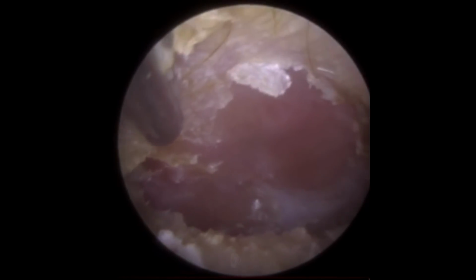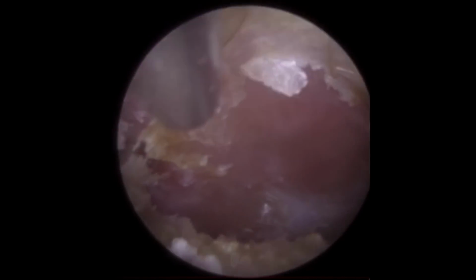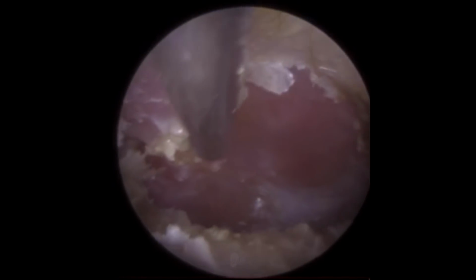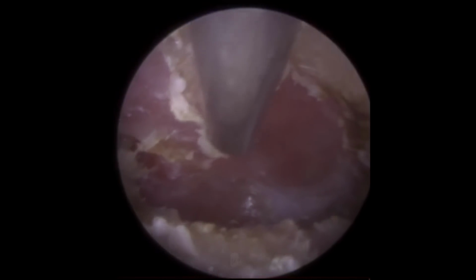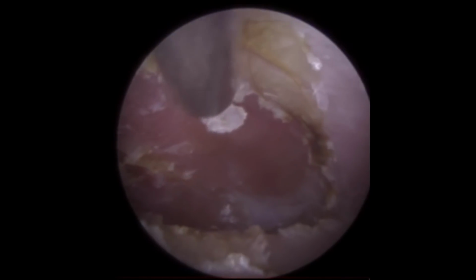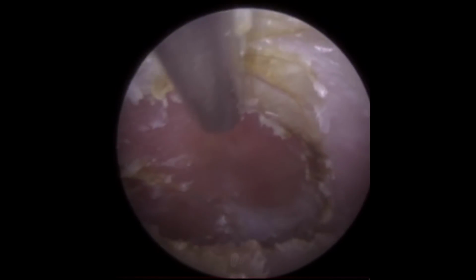So after I finished the procedure, I did perform a test called tympanometry. Tympanometry assesses the mobility of your middle ear. So the middle ear is made up of the eardrum and the three tiny bones, the smallest bones in the body: the hammer, anvil and stirrup, what is medically known as the malleus, incus and stapes. And the middle ear also encompasses the eustachian tube, which is a narrow tube that connects to the back of the nose.